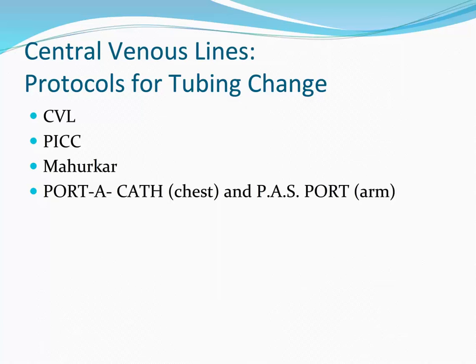The tubing change protocols are an important nursing responsibility to maintain the sterility of all catheters. Once again, this is just a review. Regular IV solutions: tubing change should be every 96 hours. TPN without lipids: tubing change every 96 hours.